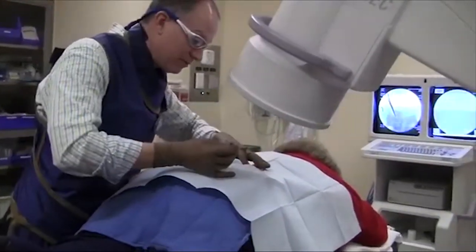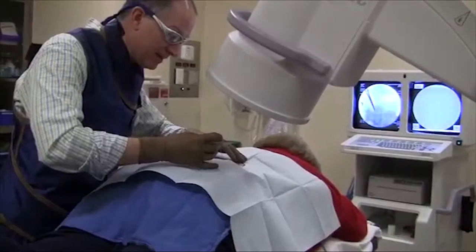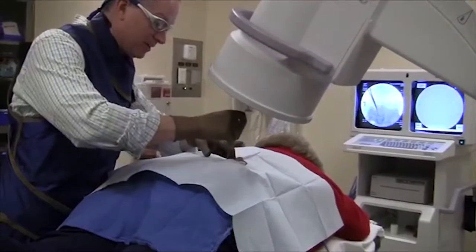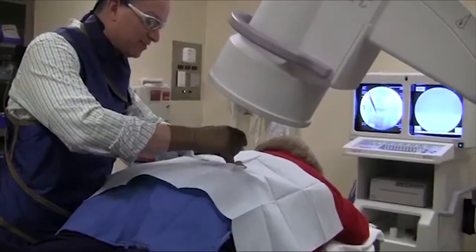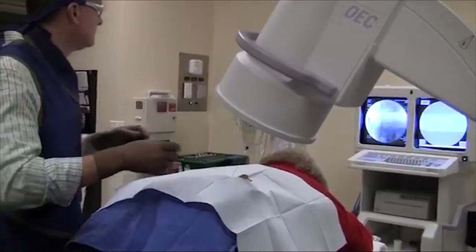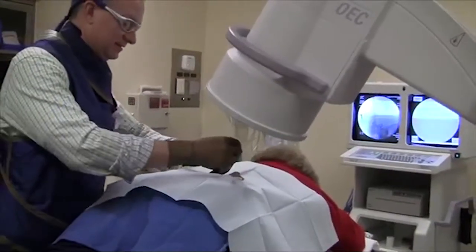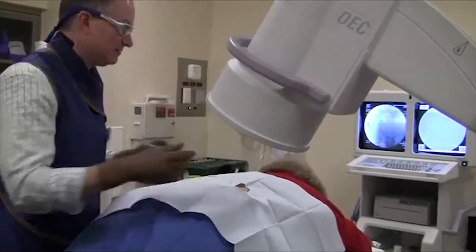Following this, the procedure needle is used and advanced into the appropriate location, again using fluoroscopic guidance.